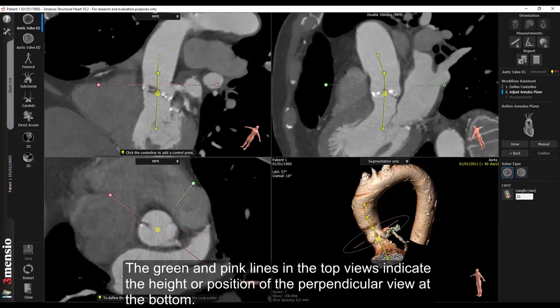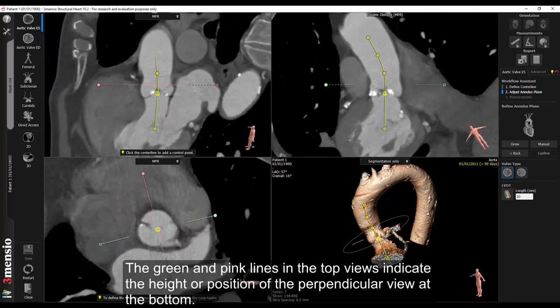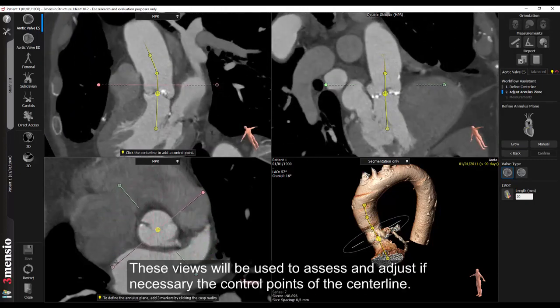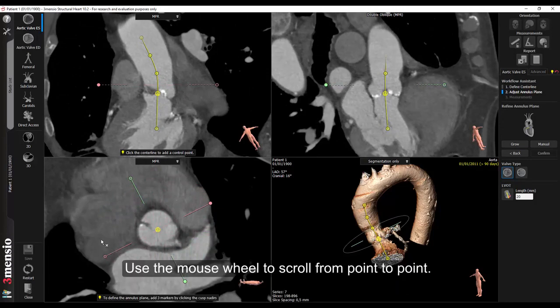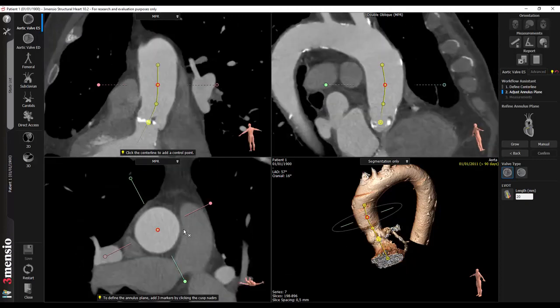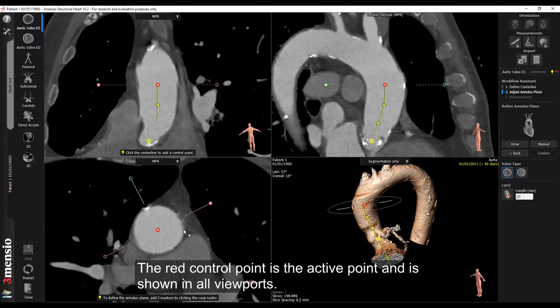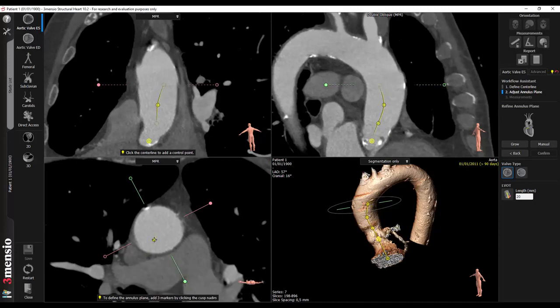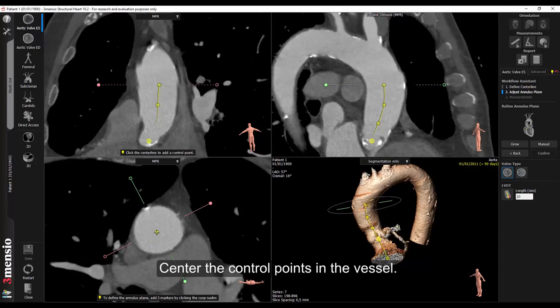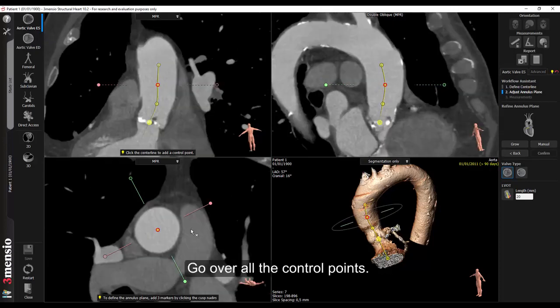The green and pink lines in the top views indicate the height or position of the perpendicular view at the bottom. These views will be used to assess and adjust if necessary the control points of the centerline. Use the mouse wheel to scroll from point to point. The red control point is the active point and is shown in all viewports. It can be repositioned by dragging it with the left mouse button to the required position. Center the control points in the vessel and go over all the control points.